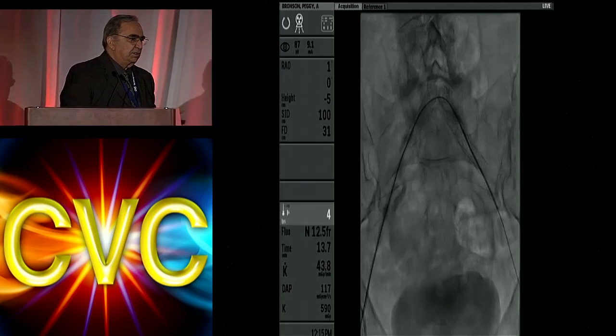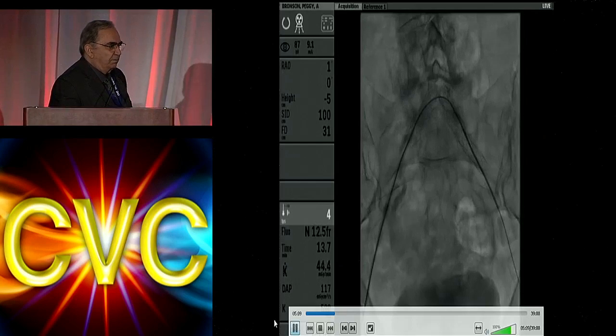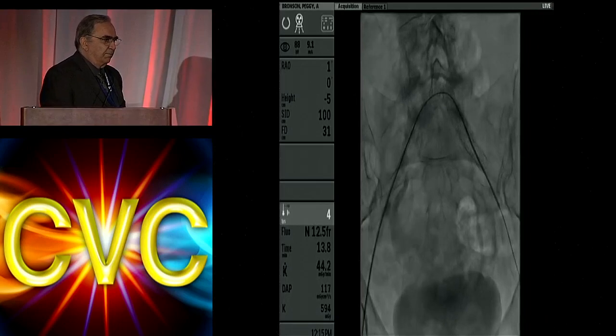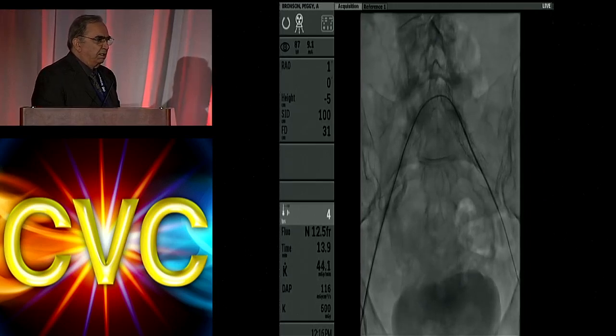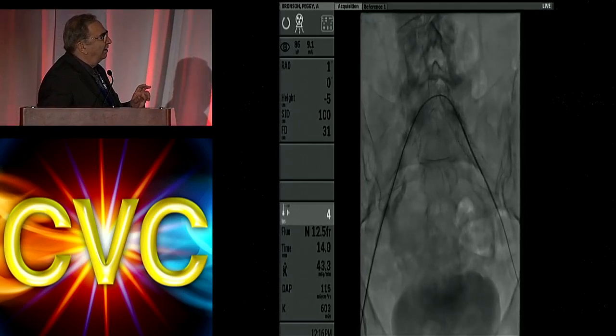So let's do that. Let's have the Viper ready, not the bare wire. And we wanted the IVUS too, huh? All right, so what we'll do is, this is good, because we'll have the Viper ready. We can use either Diamondback, or we can use Silverhawk. See, Amir, could you go ahead?